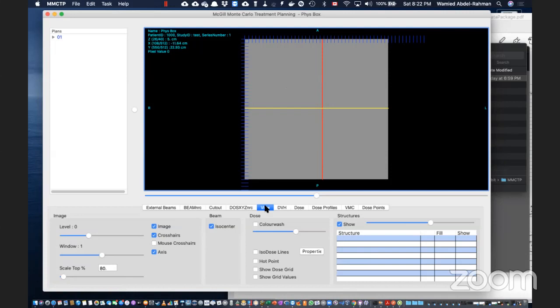And on the Windows version, the DVH still does not work, the one that I've downloaded from your site, from GitHub. For some reason, the DVH still did not work for me. It's not launching the calculations. Yeah, we saw that. I do have an old Mac. I can look at updating it to the new version.